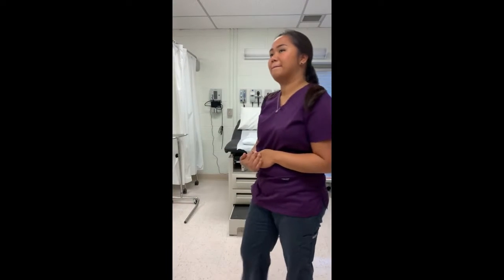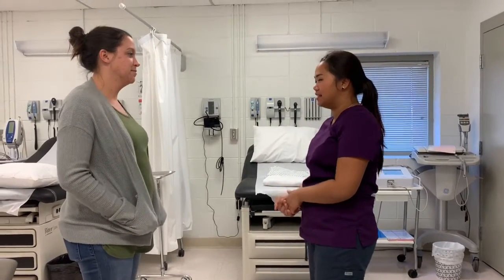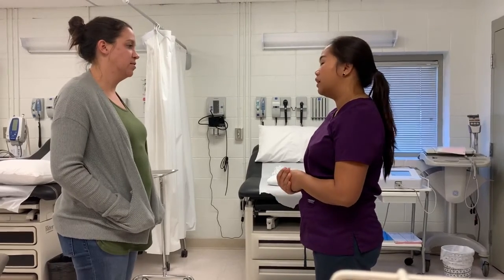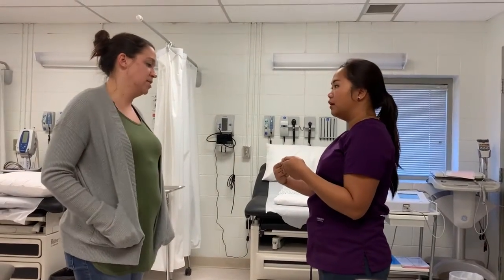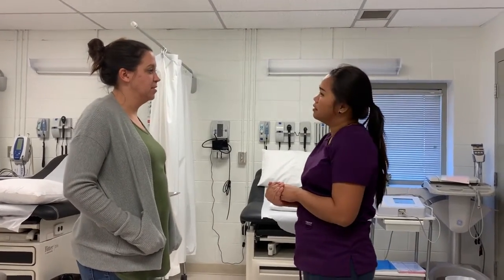Now that I'm ready, I'm going to go ahead and call my patient. I'm going to call my patient with her identification number for HIPAA. Patient 1234. Hello. Hi, my name is Casey Anna Morris. I'm an ECG technician, and I'm going to perform an ECG on you today. Can I have your first and last name? Cassandra Strauss. Do you have any ID to verify? Thank you. Can you verify your first and last name for me and your date of birth? Cassandra Strauss, 9/12/89.